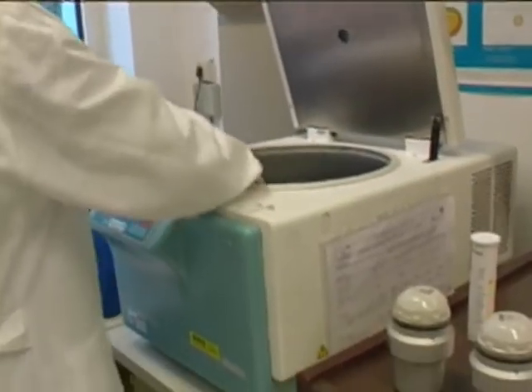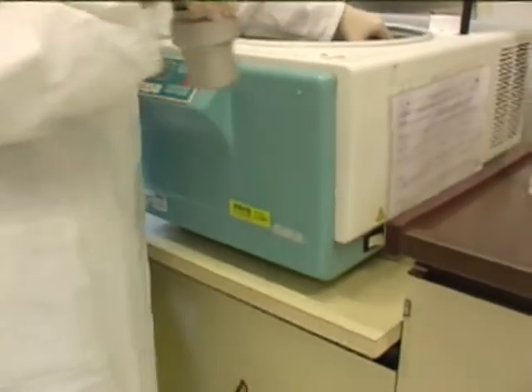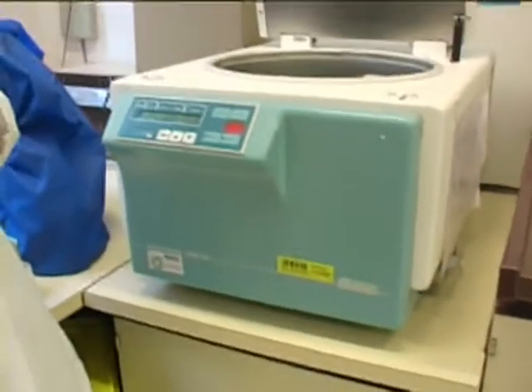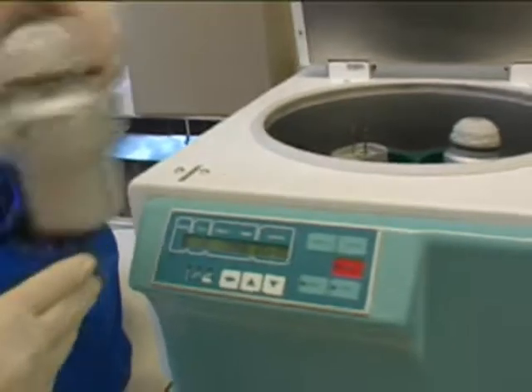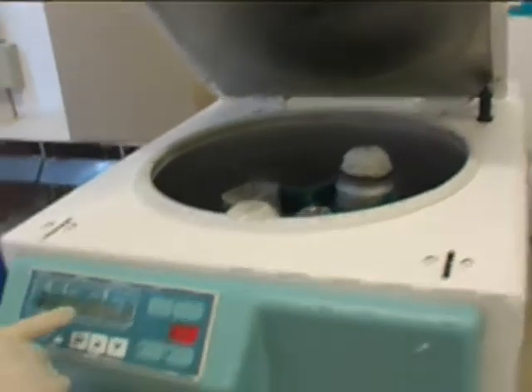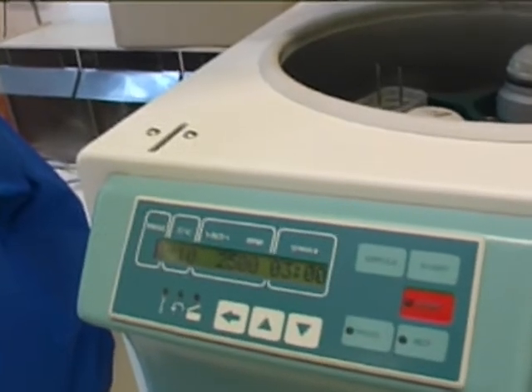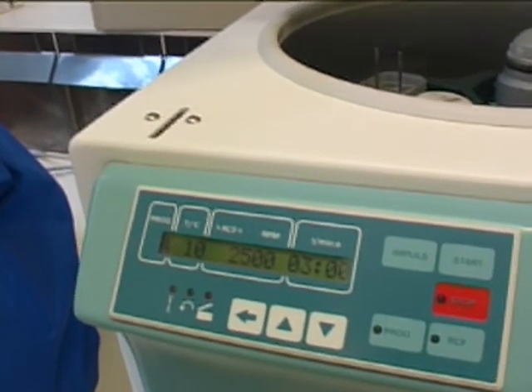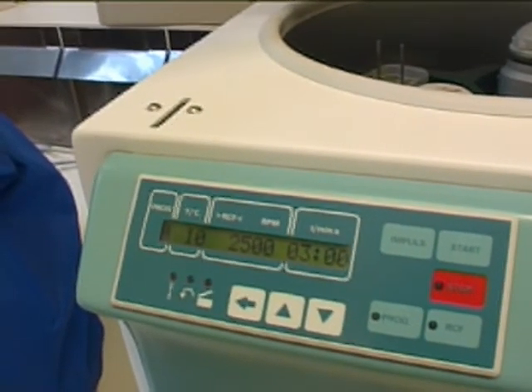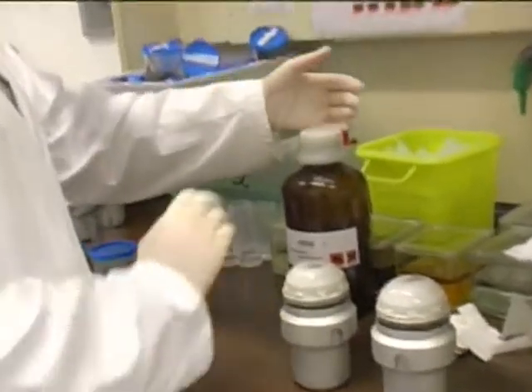The rotation speed, okay. This is a 35R. A good one. And the centrifugation speed is 10 degrees, 2500 RPM for 3 minutes. 10 degrees, that's important? Yeah, it has to be cold. Okay. This is a waste.